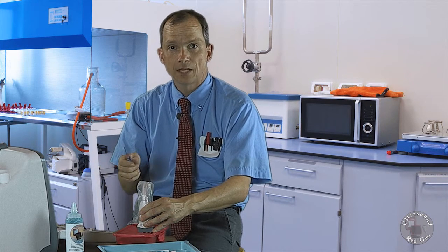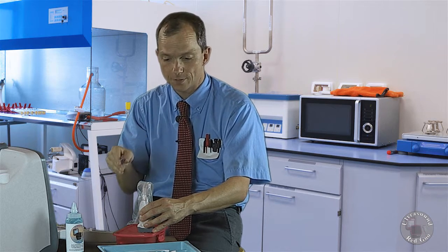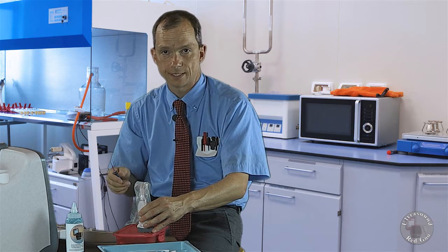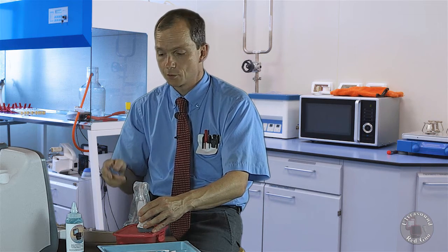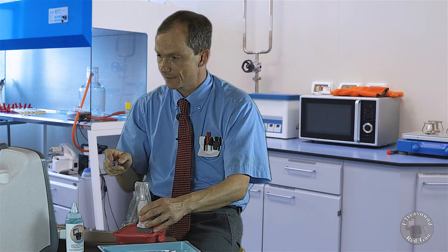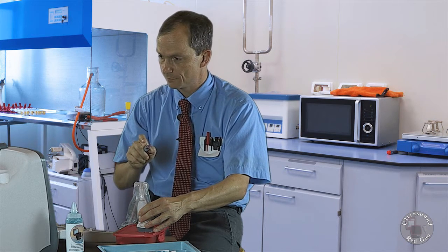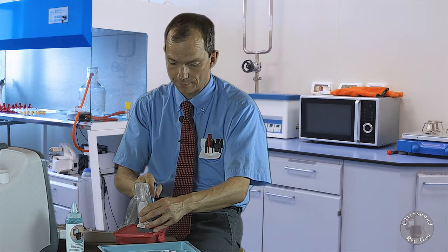The reason I'm going to use that is it's going to make things a little bit easier during this evolution for phantom training. In real life on this particular kit, which is again the 20 gauge Arrow kit, I'm going to take my own inch and three quarter angiocath needle and use that, just because the one that comes with this kit is not exactly my preference. I'm going to find my phantom vein, line up my catheter, and get ready to make my puncture.